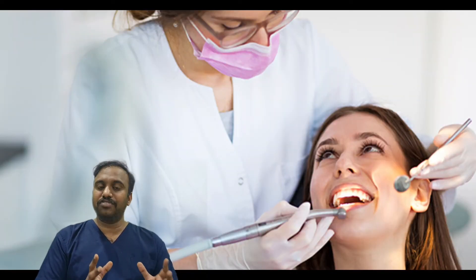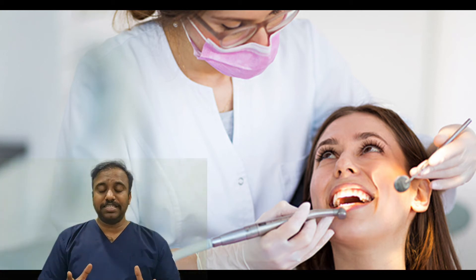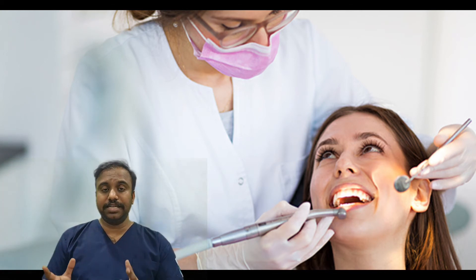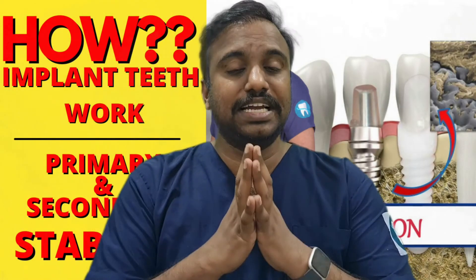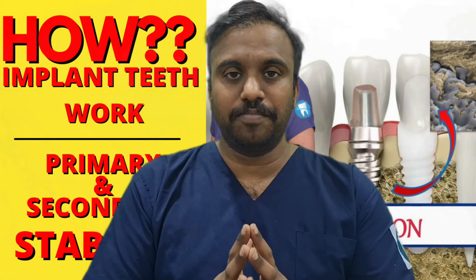This is the success of a dental implant, and this is why a dentist places a dental crown over the implant after three months. If the primary stability or the secondary stability is not sufficient enough, the implant may fail. So today we have seen what happens after placing a dental implant into your bone.